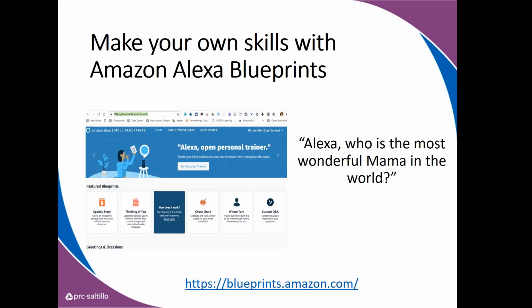So Alexa, it's open. There's a little link I have for blueprints.amazon.com. This is where you can go to actually write your own skills. The way Alexa works, it's just dialogue, right? So you say something to Alexa, and then you tell her what you want her to say back when you give her that prompt.